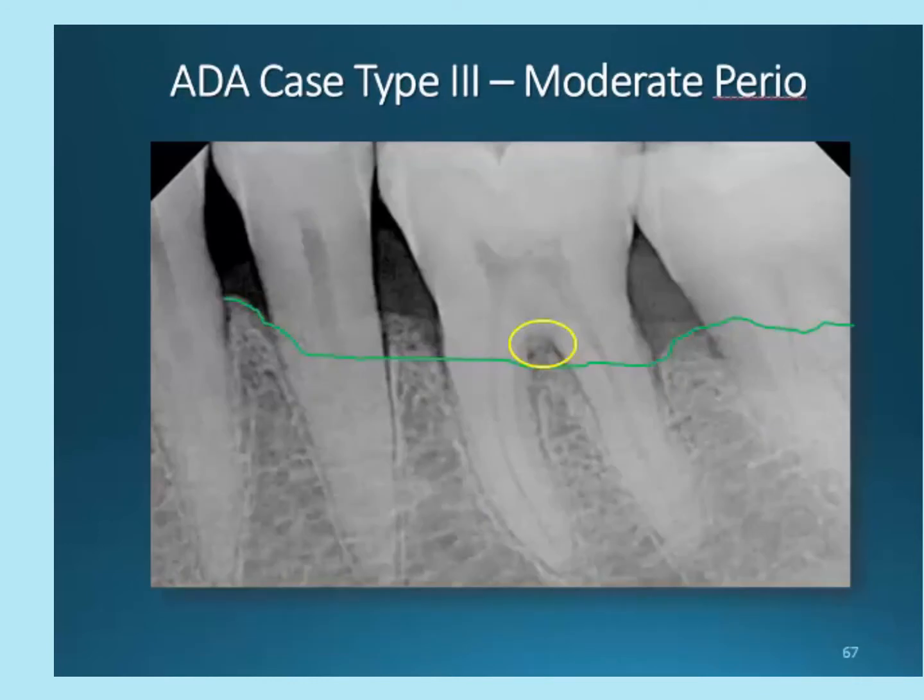This image is very good to identify a furcation. It has been circled in yellow. Bone has started to resorb in the area. However, the attached gingival fibers may still be intact, and therefore there will be no probing depths or penetration into the furcation. This is why radiographs are so important to detect these in the early stages.